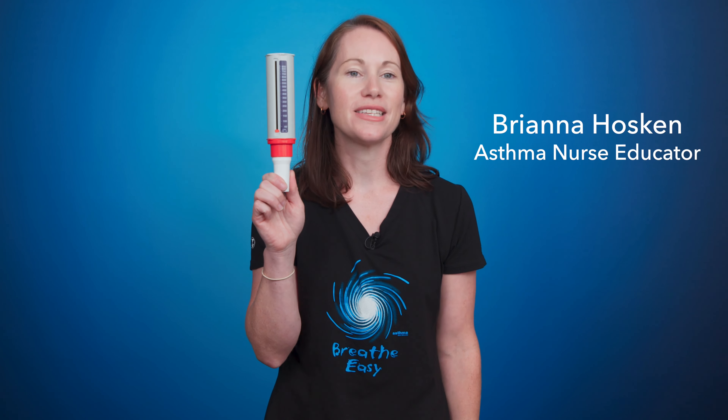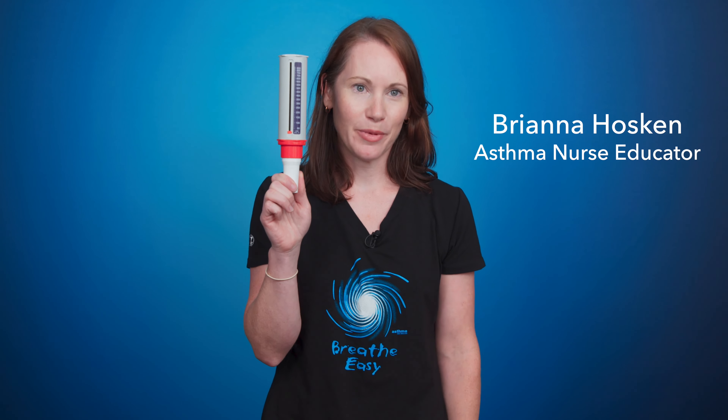This is the Peak Flow. It's a monitoring device to help asthmatics learn how their asthma is tracking. It uses your own breath to let you know whether you're getting close to your expected results or reading.